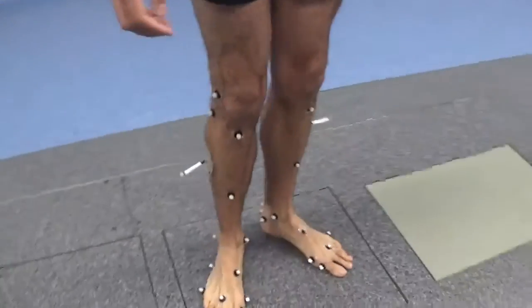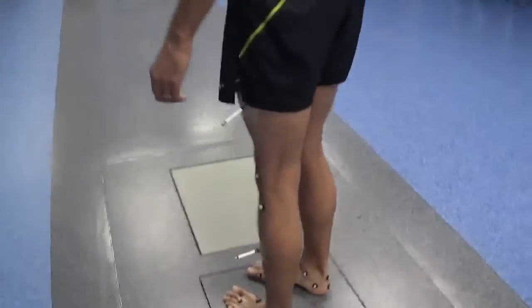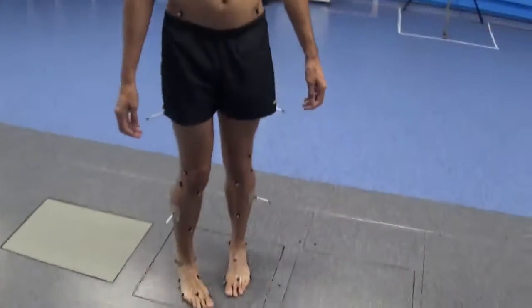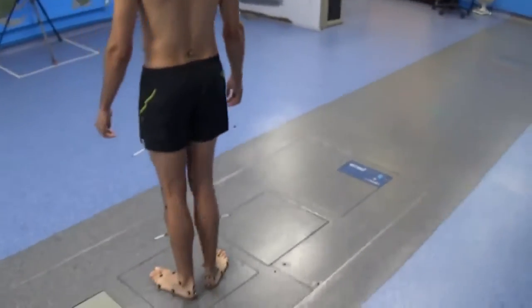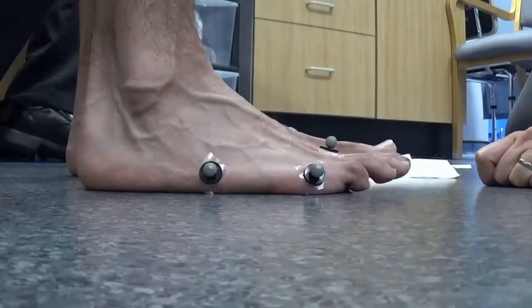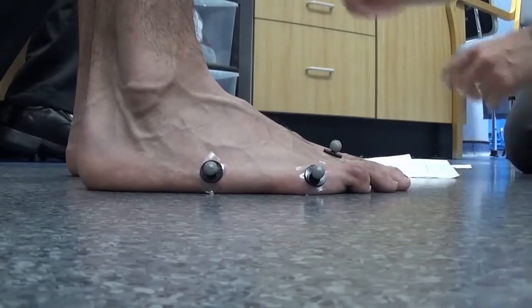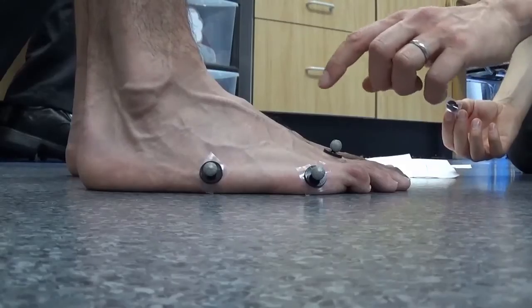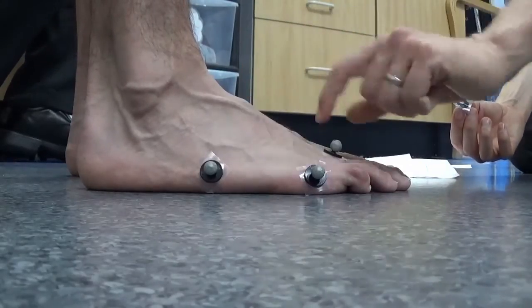Markers are placed on the skin to identify anatomical landmarks such as the pelvis, the femur, the lower leg and the feet. Walking is a complex process that involves movements in many different orientations. Think about how complex your foot is — how many different ways can you move your foot around? Even the knee does not simply bend and straighten; it has movements in more than one plane.